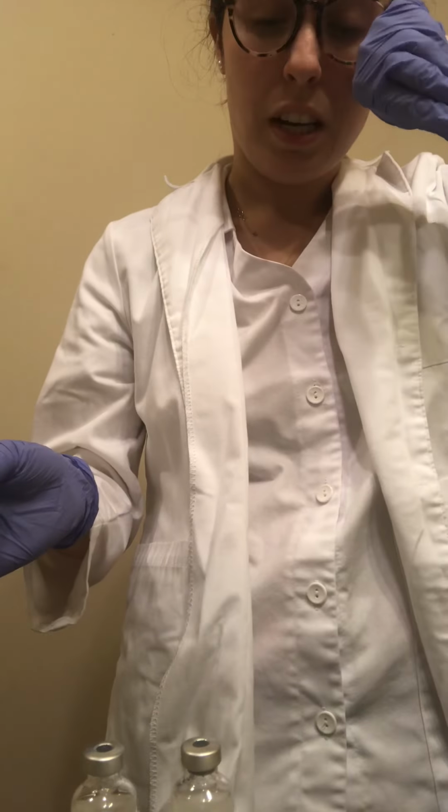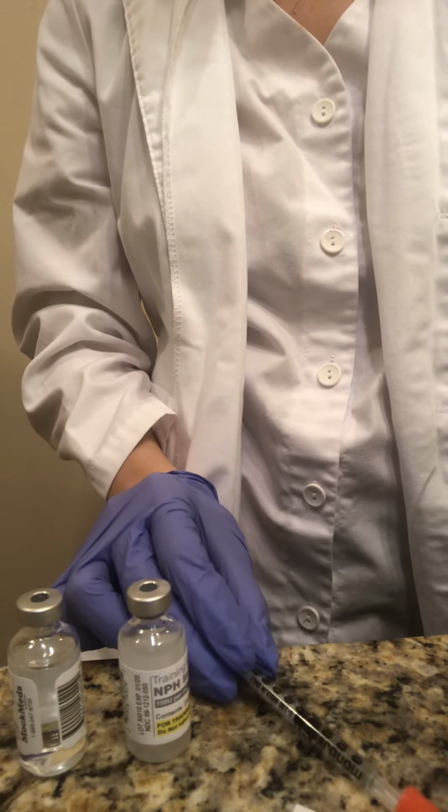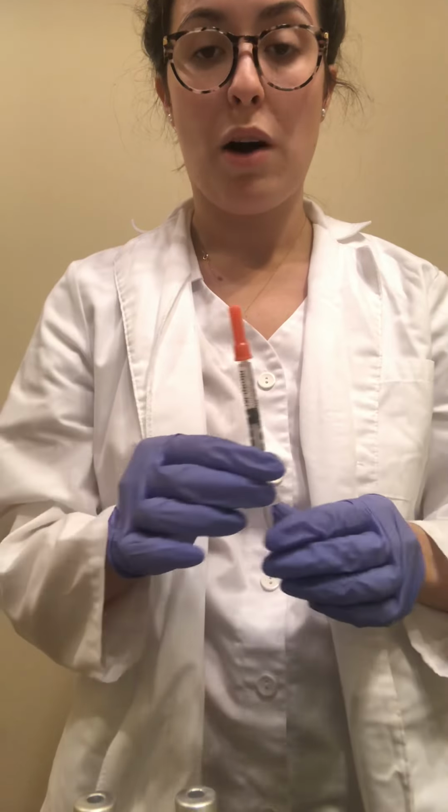And the very next thing we're going to do is safely recap this needle by sliding it into here and pressing the cap on. And I'm going to label the syringe and then verify with another nurse to make sure that it's the proper amount according to the MAR.